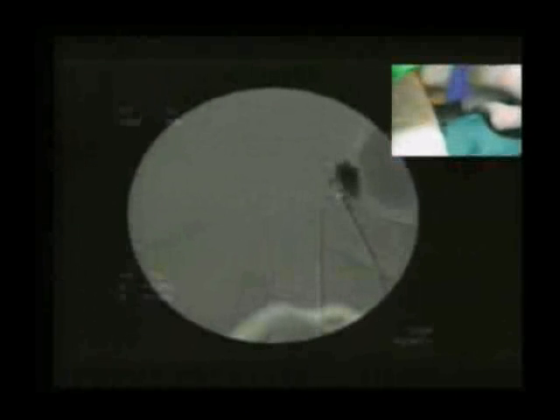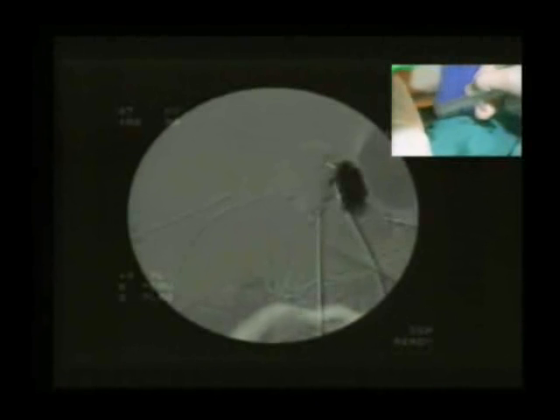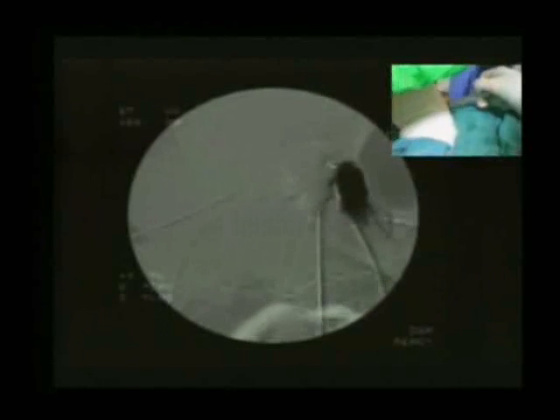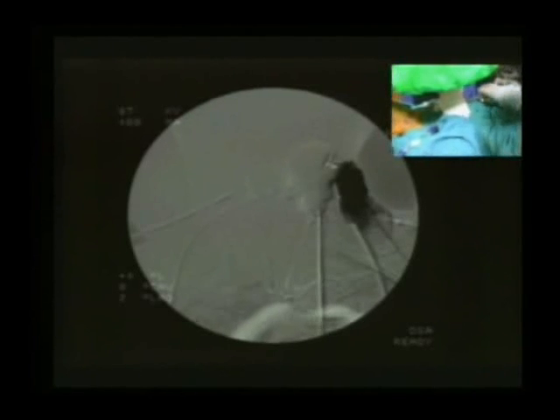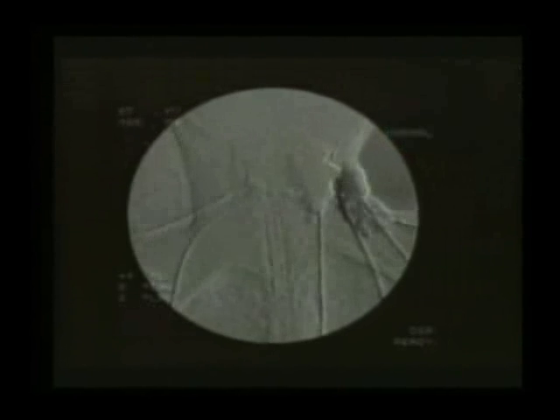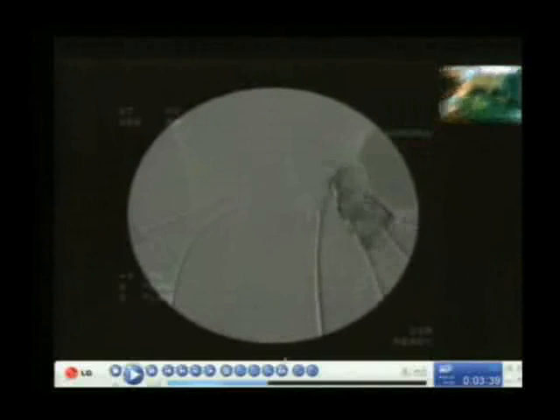I don't know many other people actually who put in multiple needles. I know people who put in maybe 2 or 3 to one part of a location in the malformation. But at the same time, before you do the venography and sclerotherapy, we found over time that it can actually help sometimes. If you've got a very, very small malformation, then maybe one needle is all you can put in.